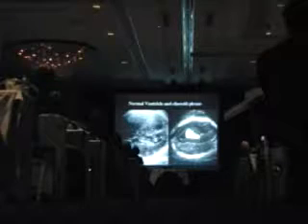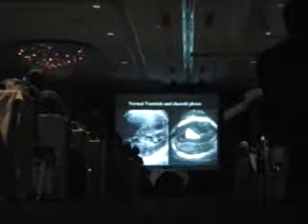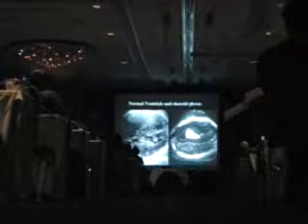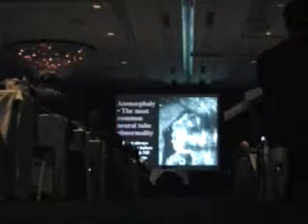But in here you can see that the choroid does fill the lateral ventricle very nicely, and there's no need to measure it because we know that qualitatively it is normal. Okay, now we'll spend some time on the spine in a little bit. I'm going to stay on the head for now. And we'll talk about the abnormals now.